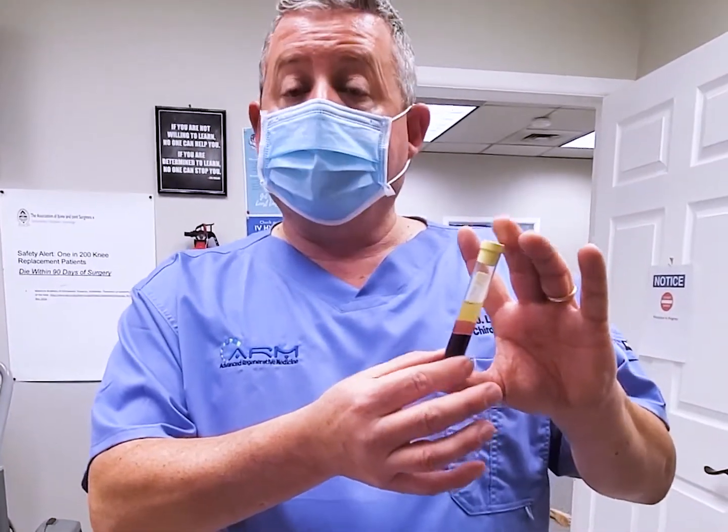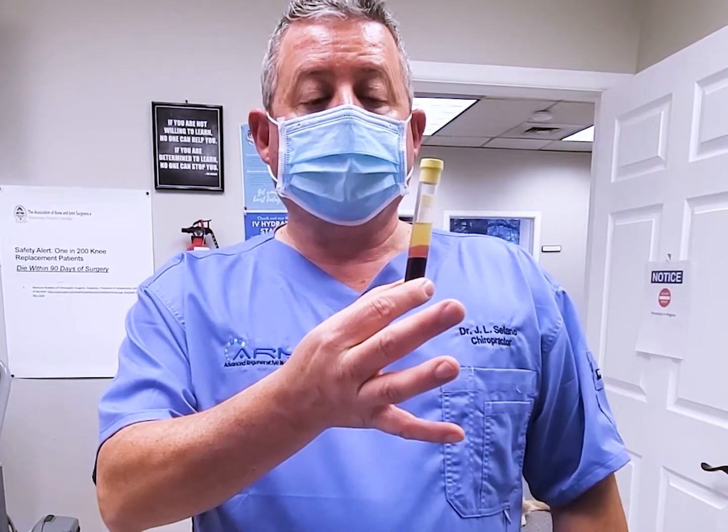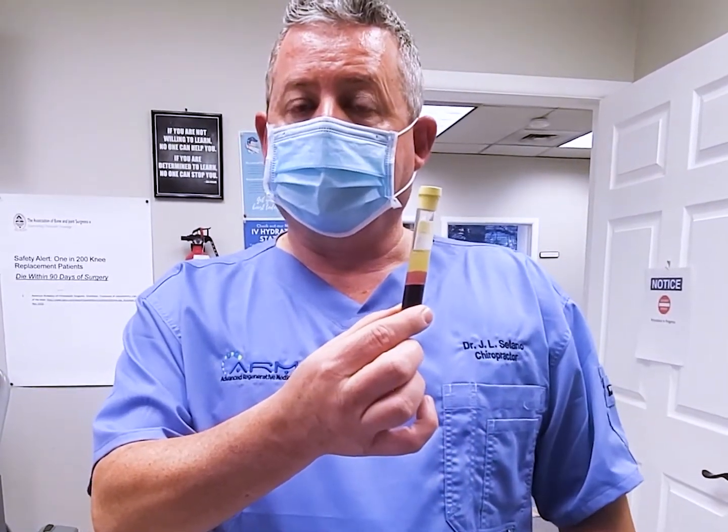So that is what the tube looks like after you've drawn the blood and you've spun it with the centrifuge. And Kelly is going to take out this amber color right here, and we're going to put that in Johnny's knee.